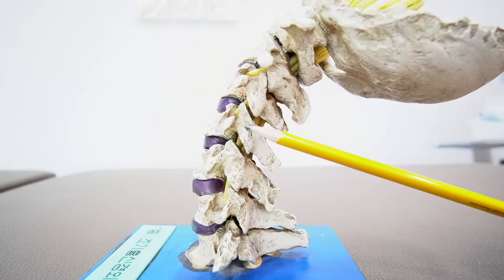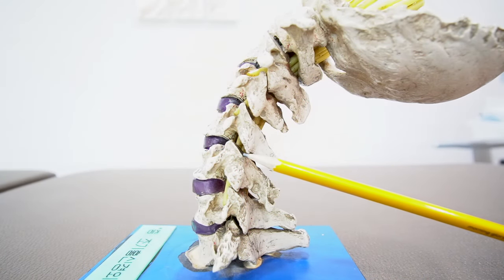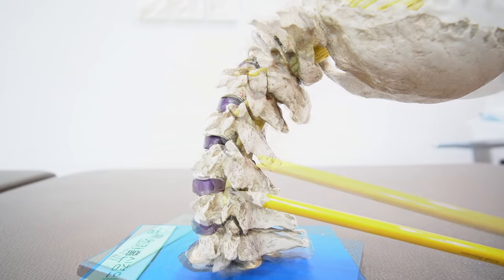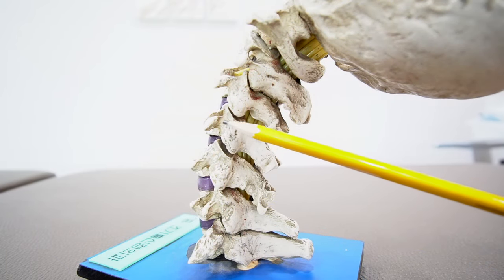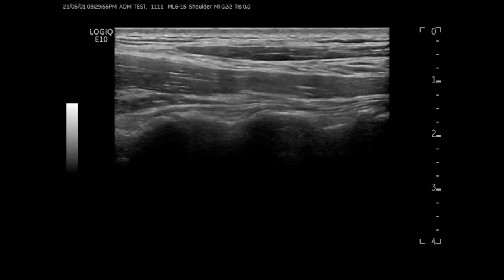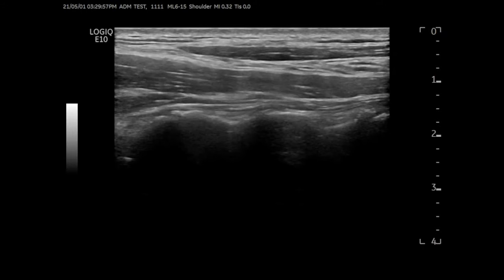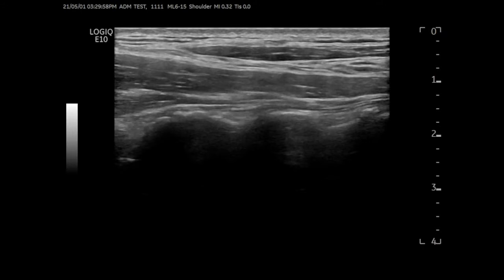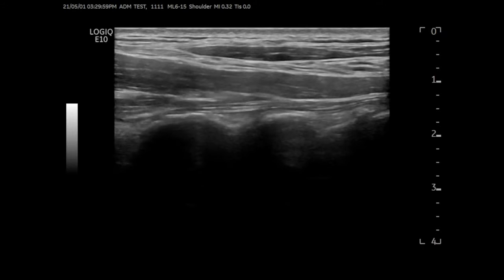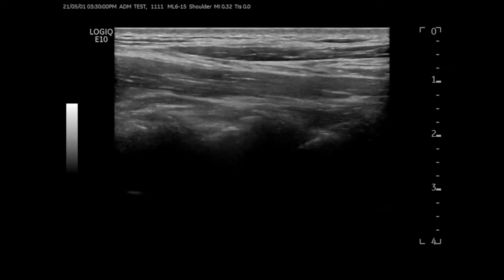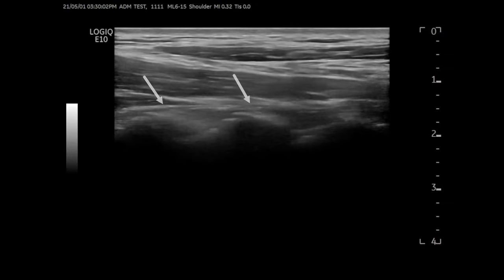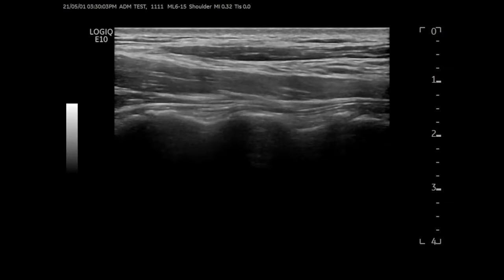As you can see from the model, it is easy to tell the difference between the facet joint and the articular pillar. However, the ultrasound image is different — the capsular window of the facet joint looks like a small slit in the longitudinal scan.